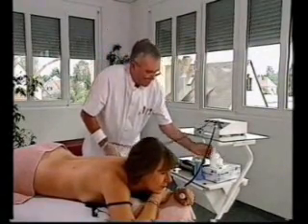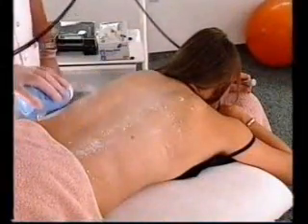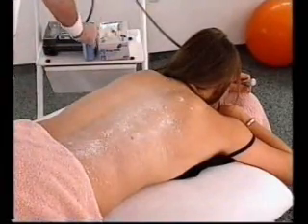The therapist wears special vinyl gloves which serve as an insulating layer. The optimum therapeutic effect is established on dry skin surface only. In order to enable an efficient therapy, powder is applied to the area undergoing treatment.